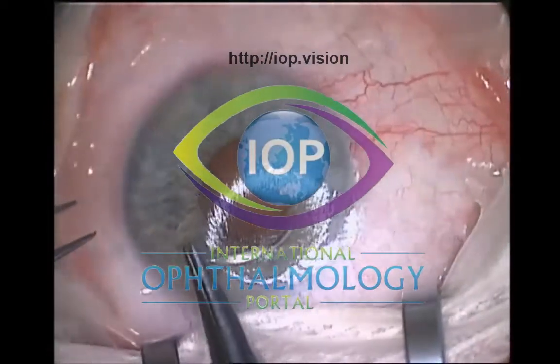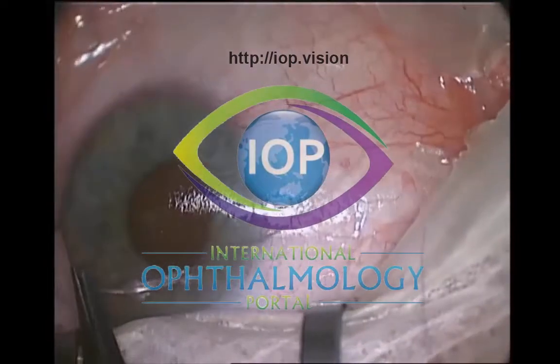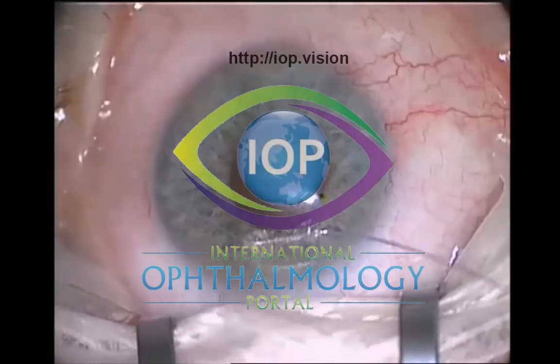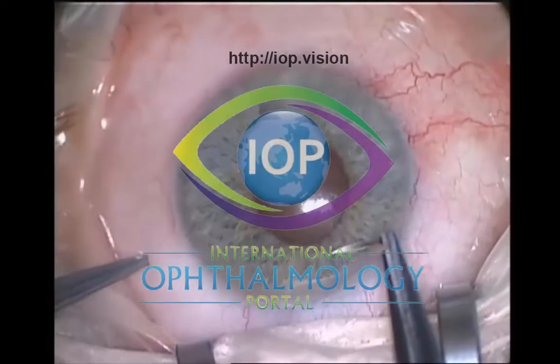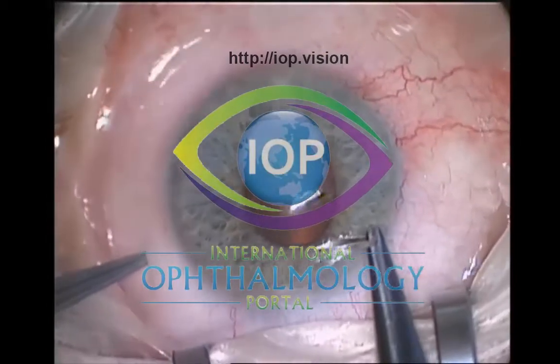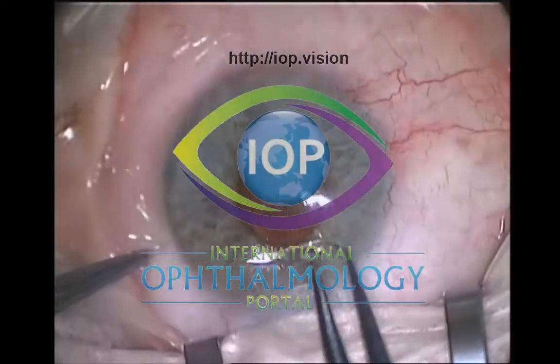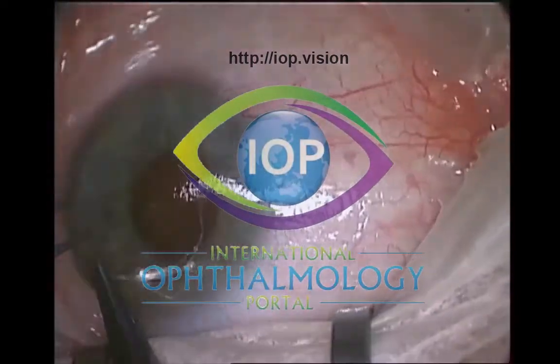Once you've got the traction suture in, it has to be strong enough to be able to infraduct the eye. I tend to use a sterile strip attached to the drape and use an artery forceps to actually attach the suture to the sterile strip on the drape. I think your technique would be fairly similar, Pete.